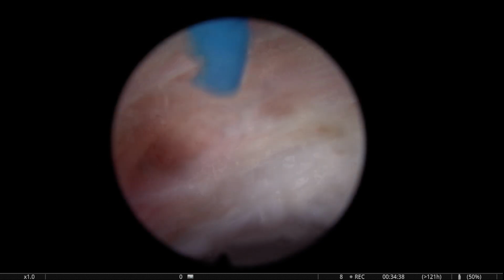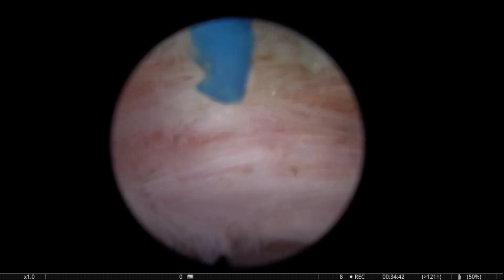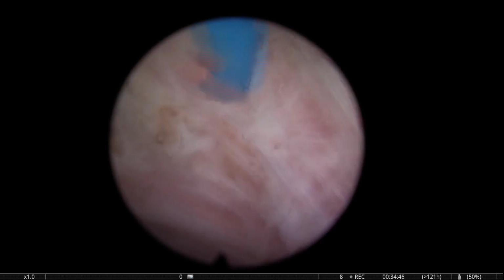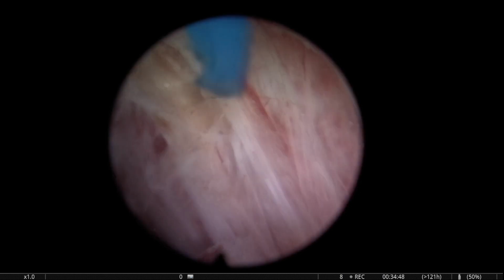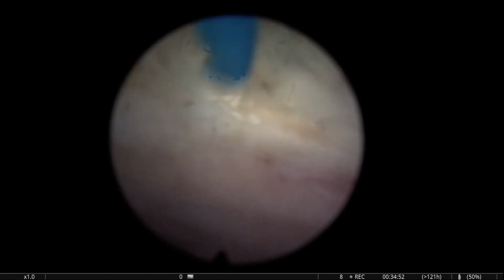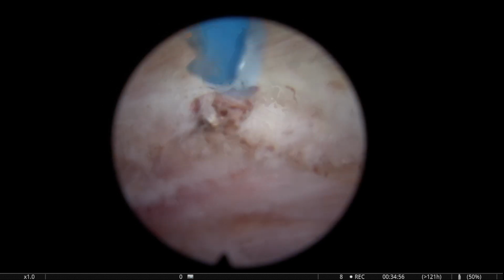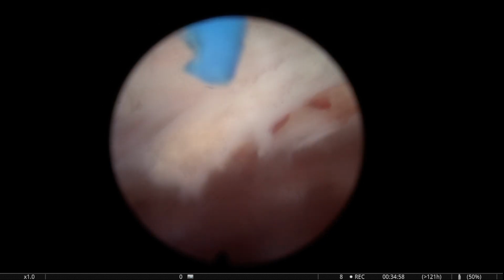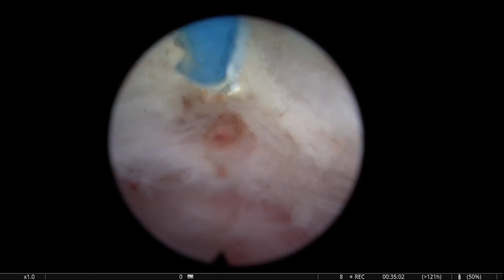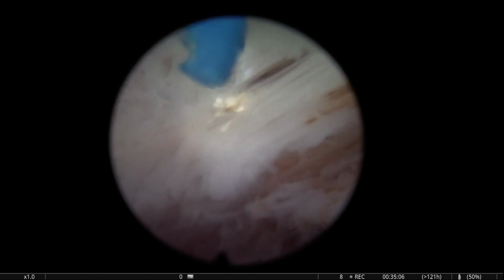Interestingly, that little perforation with some fat visible was not relevant. It was too small, and probably the way that I went below left a little flap of tissue that probably, I was even looking for it, I think, at the end, and I couldn't really see where it was clearly. So it was a very, very small intraoperative situation that I was able to manage.